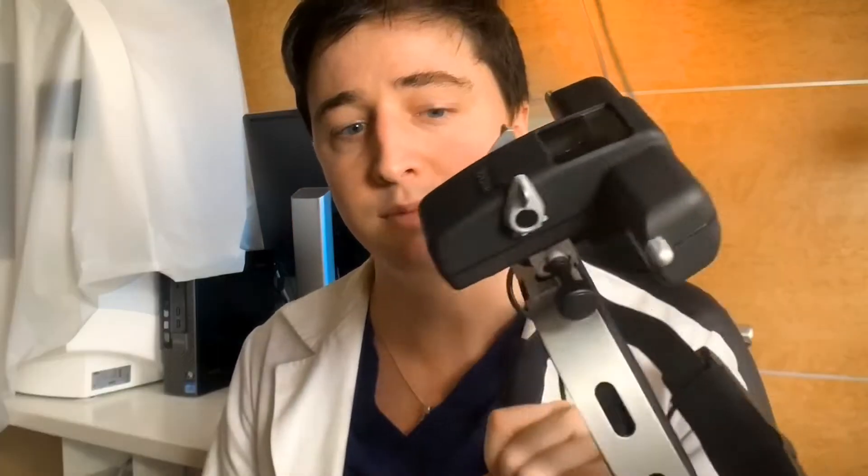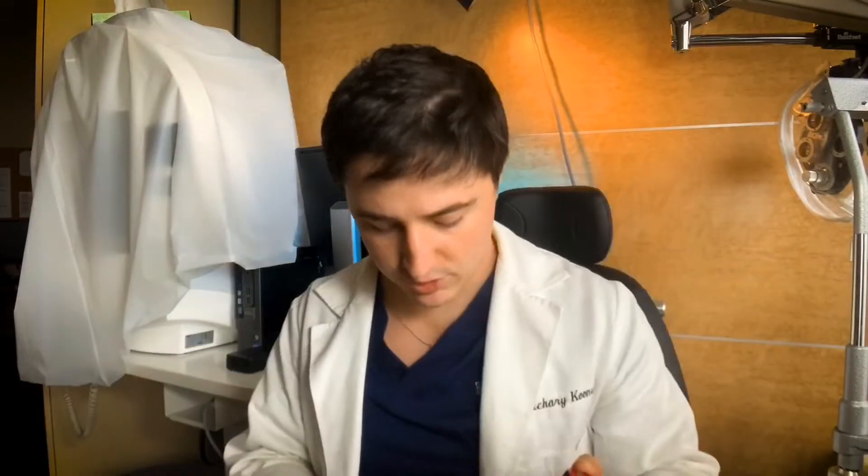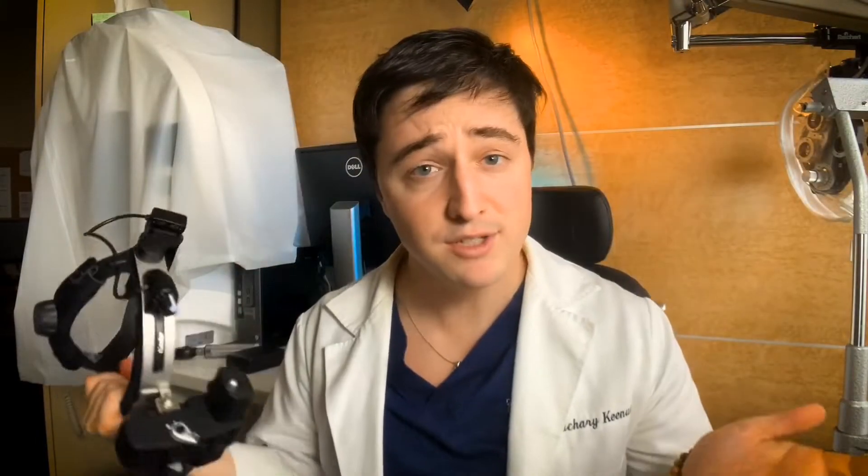The downside of using the indirect ophthalmoscope is that you need special lenses — specifically a large 20-diopter lens like this. That just refers to how much it bends the light coming into it, but it's basically just a lens. And you need this to be able to view the retina with the indirect ophthalmoscope. Let's go over how to use it so you can actually get a good view of the retina.